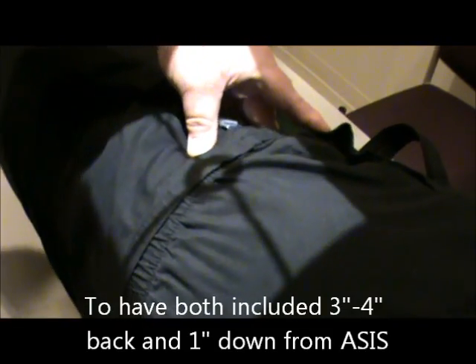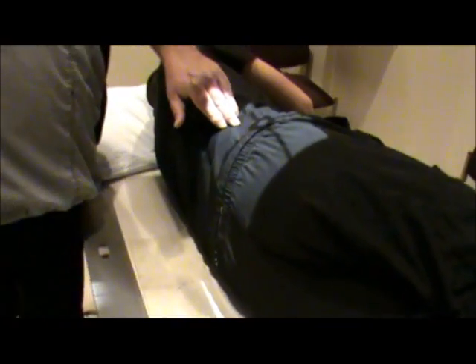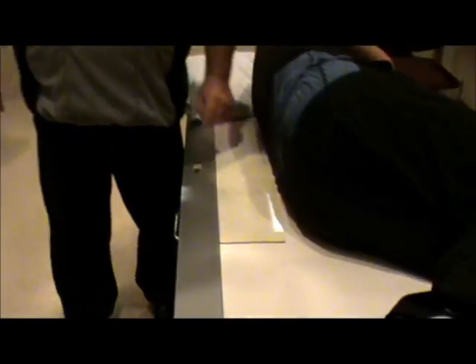Most places want to include both sacrum and coccyx on one lateral. We palpate the ASIS and go straight back three to four inches. From that point, it's only one inch down, which will include both the sacrum and the coccyx. Make sure collimation is to the IR borders lengthwise, since we're trying to see both. Technical factors remain 81 to 85 kVp, center cell with automatic exposure control. We still use the lead blocker and shielding to the front of the patient. And this is our sacrum and coccyx lateral.